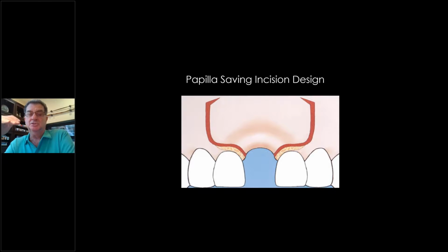I'm going to do incisions like this, called papilla-sparing incisions. I don't want to sacrifice the papilla in order to build up the buccal, because once you lose it, just like Dr. Elaskary showed or said, you can't regenerate it surgically. It's not there unless you do orthodontics, and you don't want to start doing that when you had the papilla to begin with. Every time you open it up, you lose more bone.